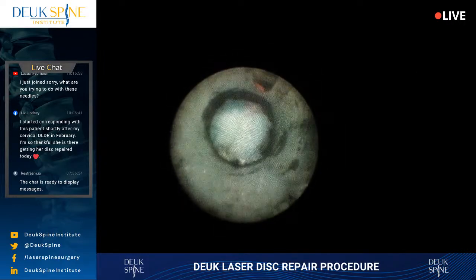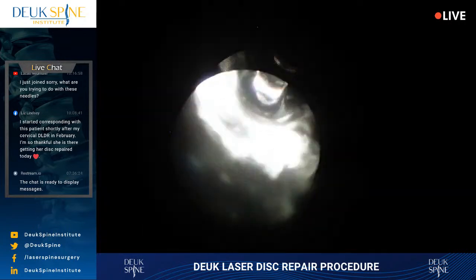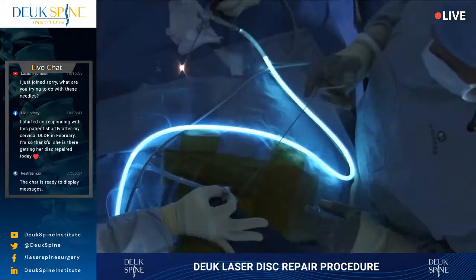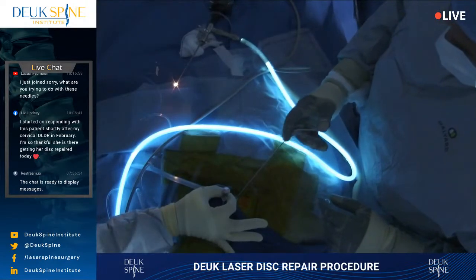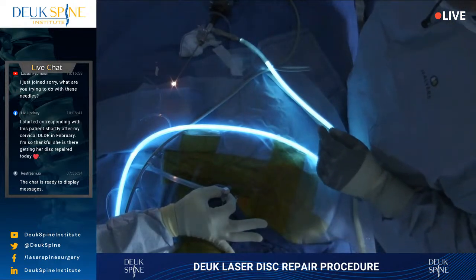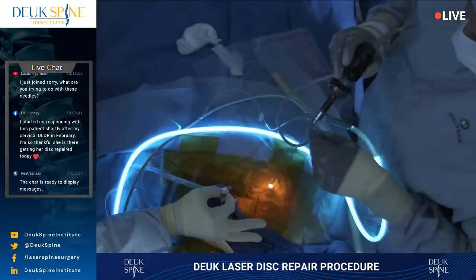There's herniation right there. Wow, that's a big one. Grab her. So that came out of the neuroforamen on the left, which is the side that we're most concerned with. There it is. Nice little chunk. Let's go back and take a look.